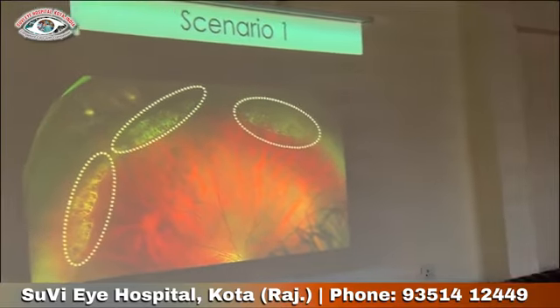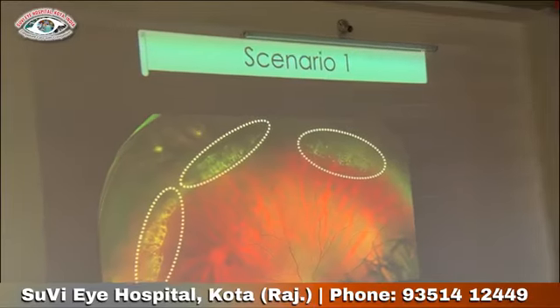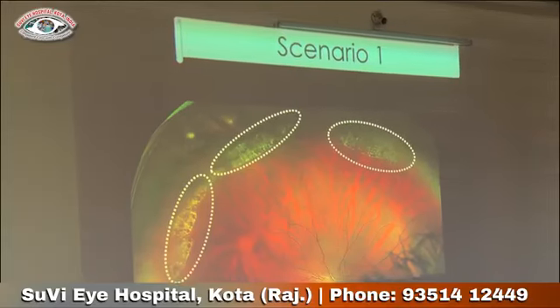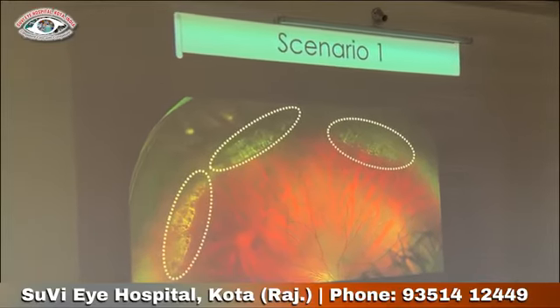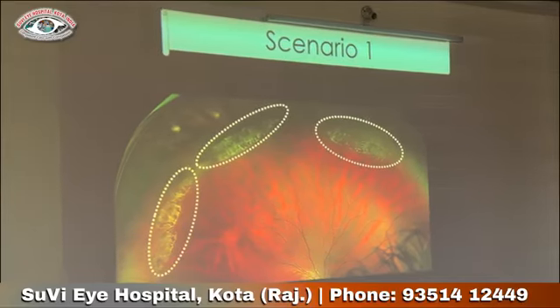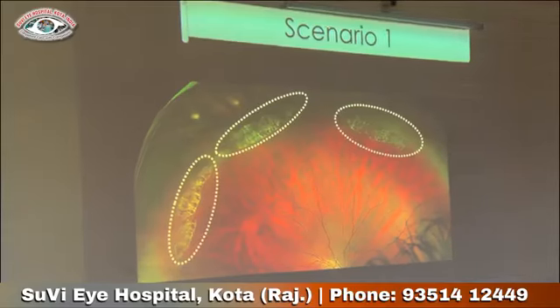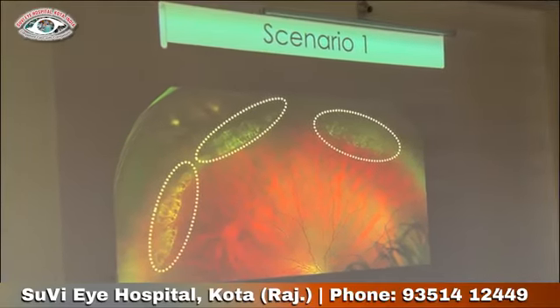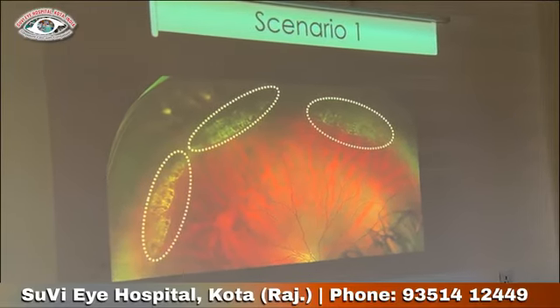Yeah, so very nice point. As much as possible, you should cover the individual lattices. Some consultants say that you can do the anterior border first because it is difficult to laser. But while doing the anterior border, because the retina is thin, some patients feel a little bit of pain. It is not a completely painless procedure, as we experience day in, day out.